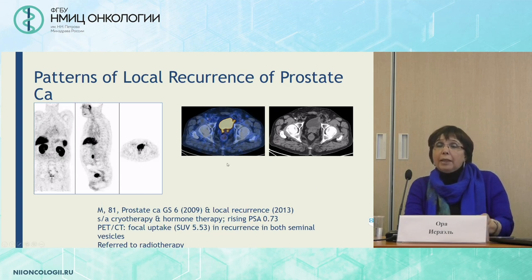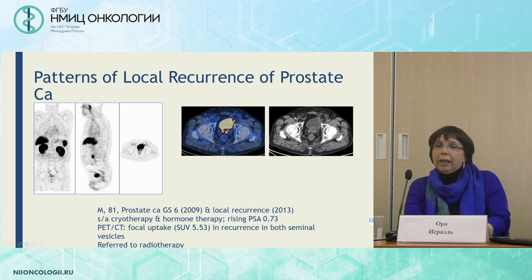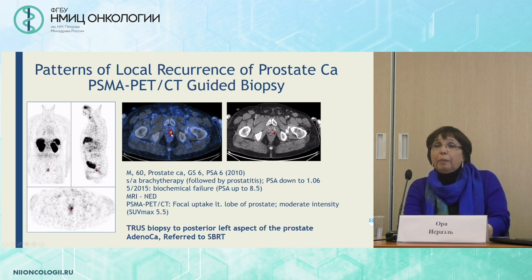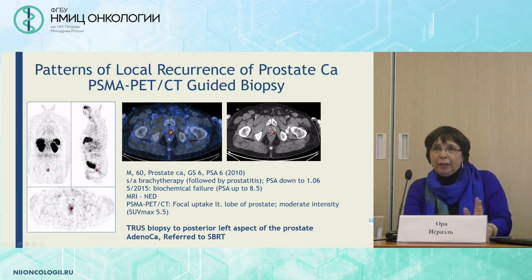When we deal with local recurrence of prostate cancer, we can see here one example of uptake in a recurrence involving both seminal vesicles — this was not known prior, and based on this study, the patient was referred to radiotherapy. This is another patient where we see this area of faint uptake in an area previously treated with brachytherapy. The uptake was not of very high intensity. We referred the patient first to biopsy, following which the final diagnosis led to referral again to radiotherapy.